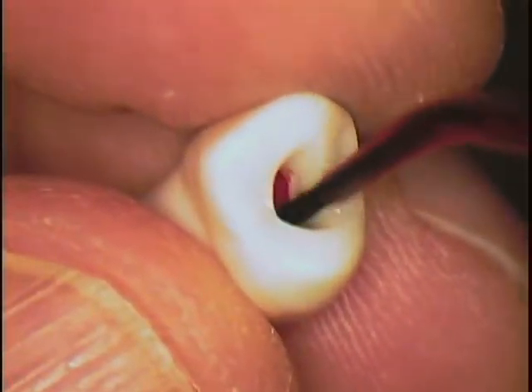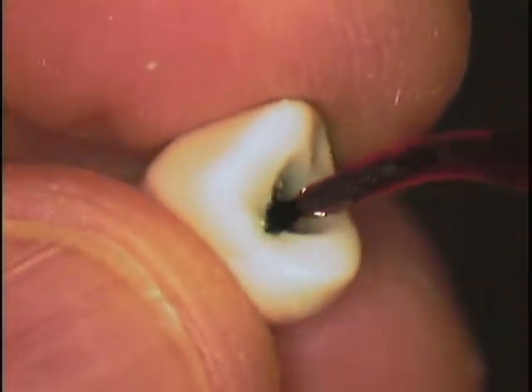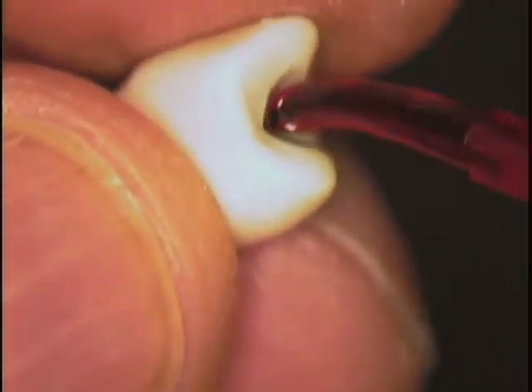I changed my collet first. So this is where you want to use a lot of lubrication. These post drills are very easy to snap and break, so you want to be very careful using them. So I recommend definitely lubricating first. So drop in your lube. Suck back a little bit out of there.